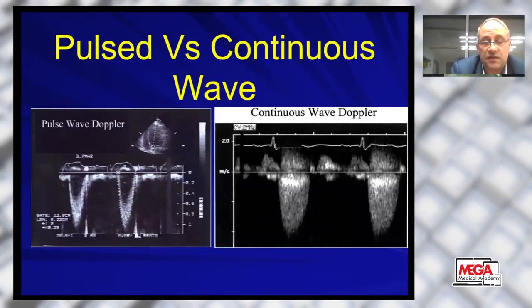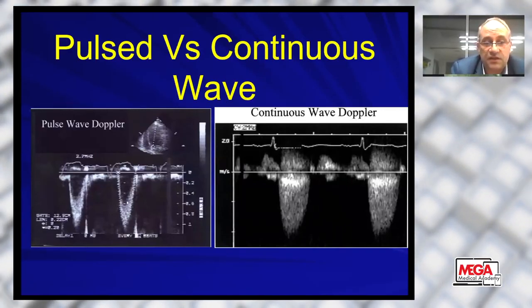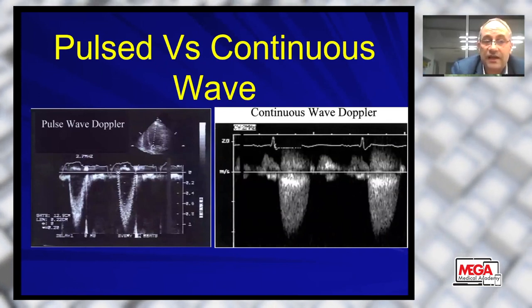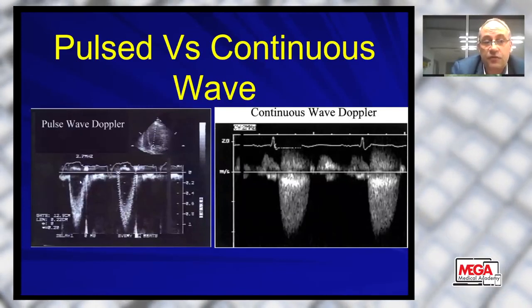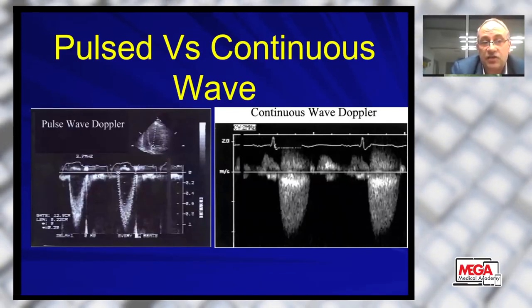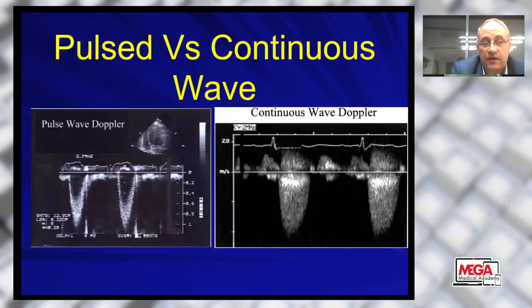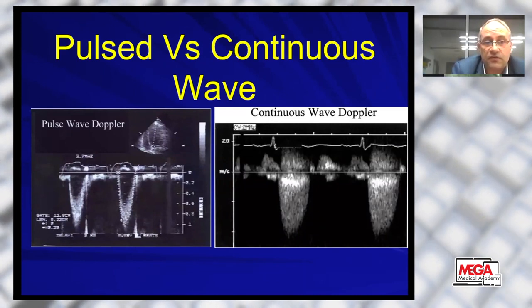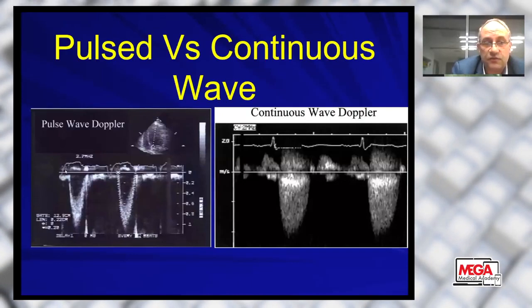They represent Doppler beams hitting the blood cells and returning to the transducer to be presented as white dots. The direction of blood flow is in relation to the baseline, or the zero. So here the blood flow is away from the transducer because it is on the negative side of the scale.